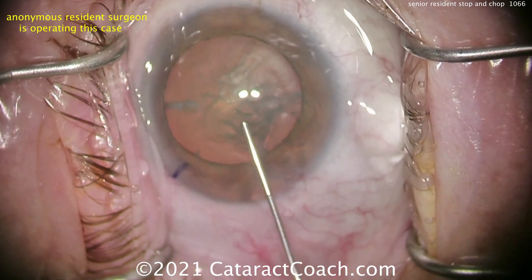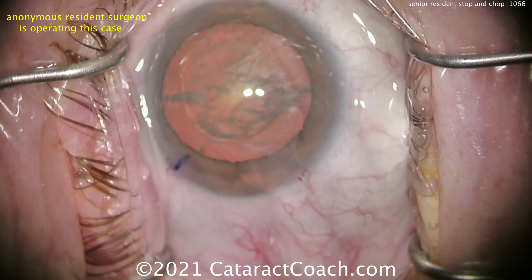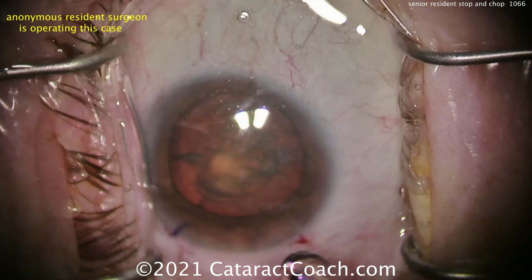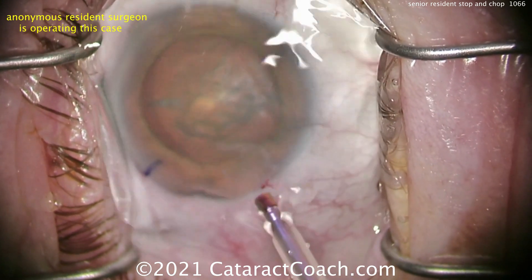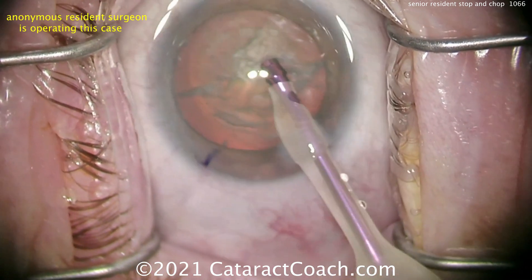A little more dispersive viscoelastic right in the center — you must have seen that on CataractCoach.com. Now let's see the phaco technique. Here comes the phaco probe. Looks like maybe a 2.4 sleeve, which looks great. Going in here. Let's see what's coming in the side port.